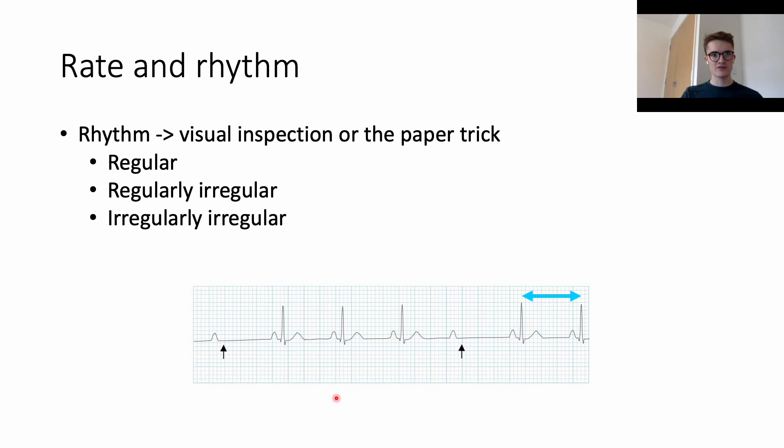So while it's an irregular rhythm, it has some regularity to it. It has these stretches of two or three QRS complexes where the rhythm is maintained at a regular rate, and then it drops off and gets a regular rate again. We would call this a regularly irregular rhythm.